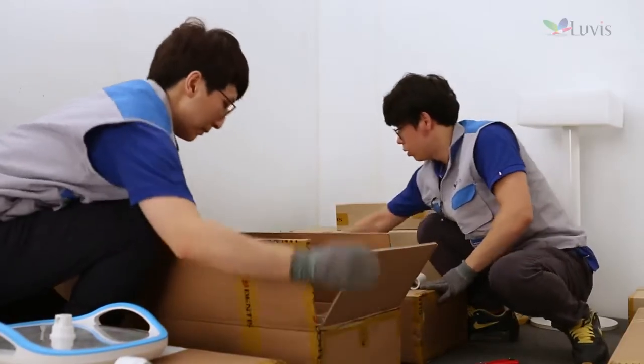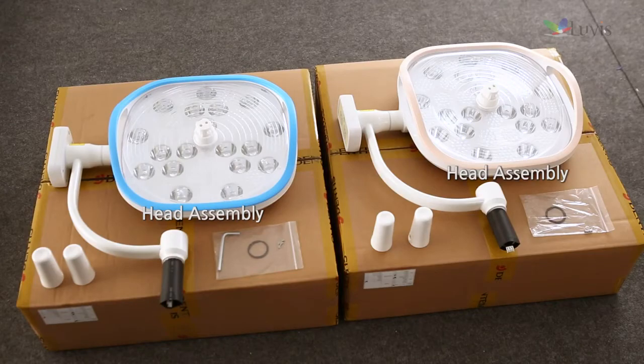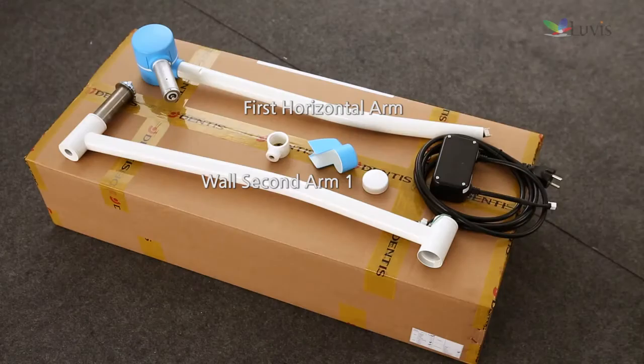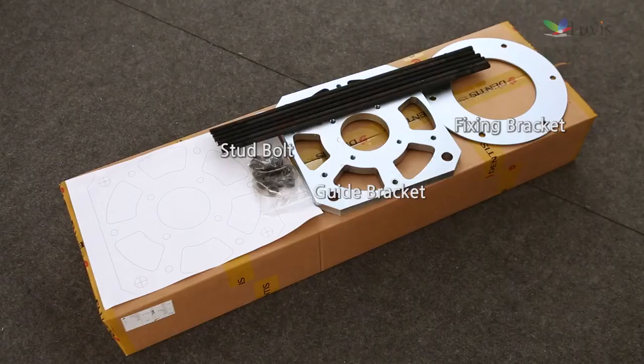Check components after opening the package box. Components include: the head assembly box; the first horizontal arm 1 and wall second arm 1 and 2 box; the dual ceiling vertical arm, ceiling cover, and ceiling cover bracket box; and the guide bracket, fixing bracket, and stud bolt box.